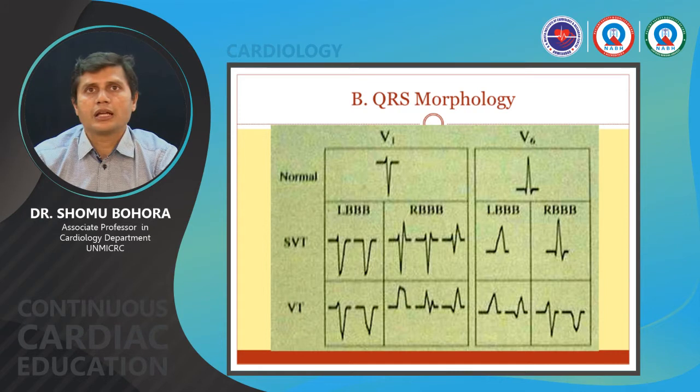While in ventricular tachycardia you may have a typical bundle branch block pattern, especially in bundle branch reentrant VTs. However, most of the scar VTs will demonstrate an atypical bundle branch block pattern. In RBBB, it is characterized by an initial R that is taller than the later R, or a monophasic R pattern in V1.